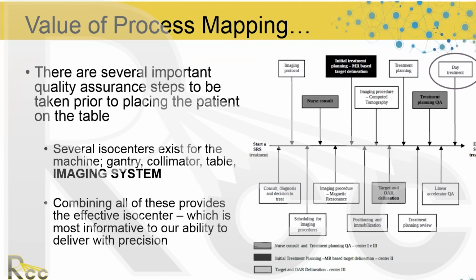You should assess that. You should set up your Winston-Lutz, I do, to also assess your imaging. So I cone beam the BB, set up the BB, and then deliver the treatment to the BB, because this is what we're doing with the patient, and that should be within a millimeter. Or if you're doing SBRT, the tolerance may be a little different.